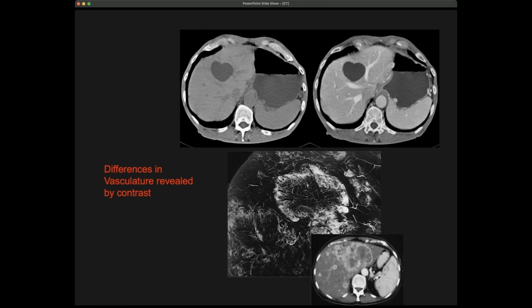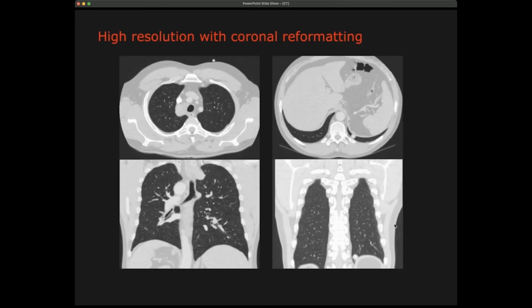And so an aggressive tumor needs a lot of blood and is actually growing so fast that the blood vessels can't follow, and that inside the tumor, you don't have blood vessels. And then you start to see that there's necrosis inside, and there's a lot of very highly perfused tissue around. So by looking at the dynamics of contrast, so looking at whether it's a highly perfused organ or region, yes or no, we can discriminate some of these types of tumors, for example.